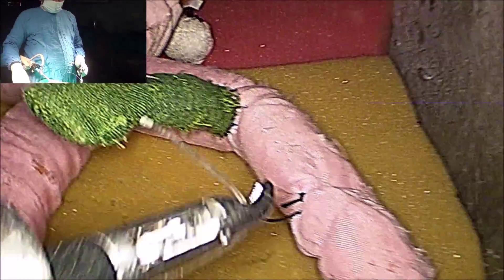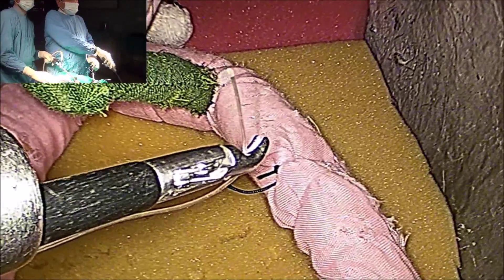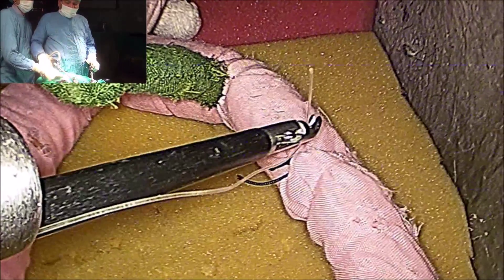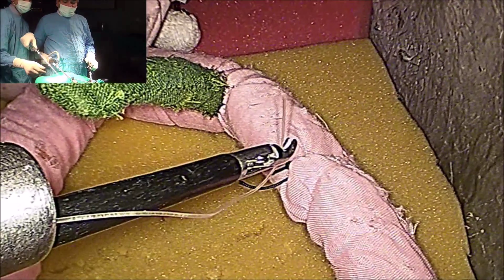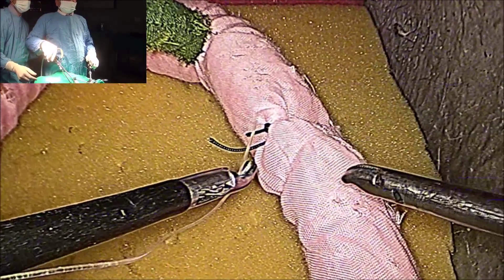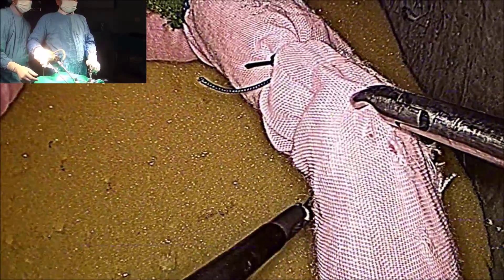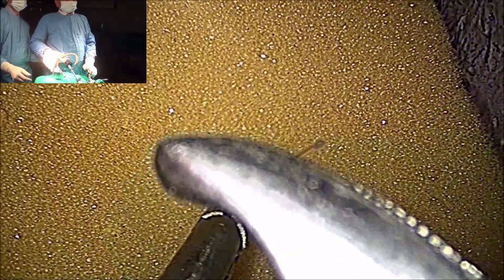Once it is in, you already have a window formed — maybe in between the cystic duct, cystic artery, or inside a renal artery, or a splenic artery. Then you go behind. Once you go behind, you will fly over to the barrel and catch that suture.